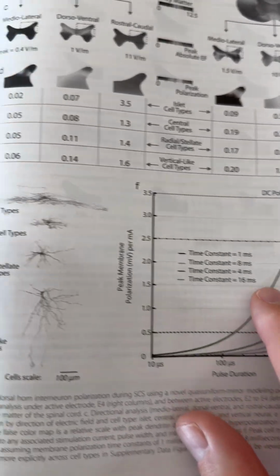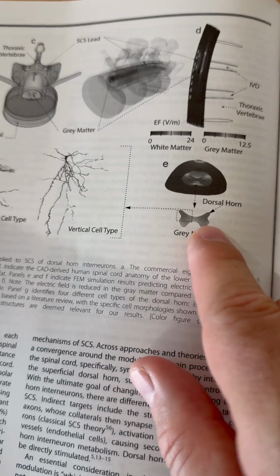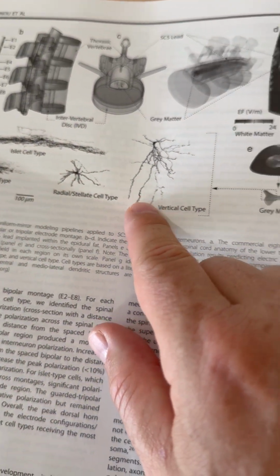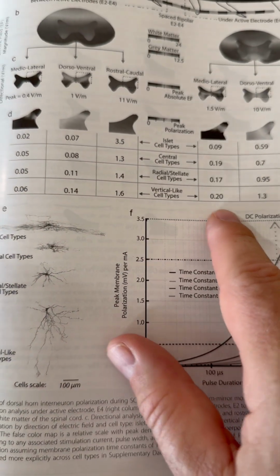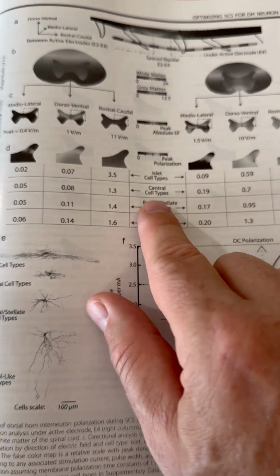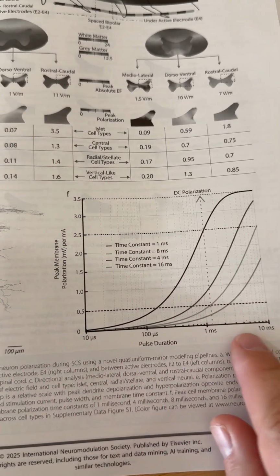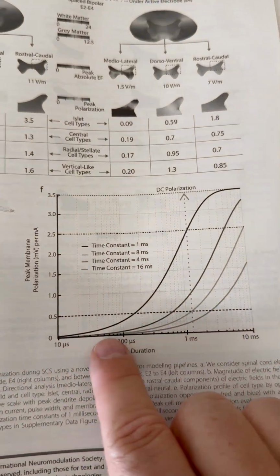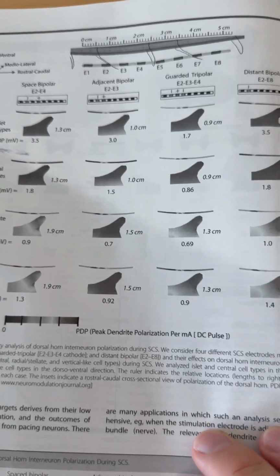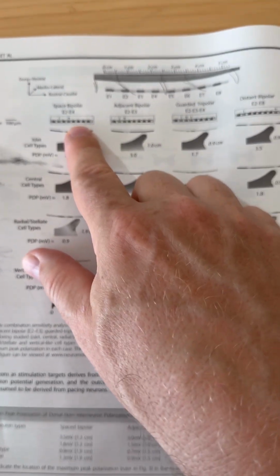Some current does get into the dorsal horn. That current will inevitably polarize the interneurons that are there. How much they polarize will certainly depend on the interneuron location as well as the type, and will strongly depend on the pulse duration that is used. And that's the paper.